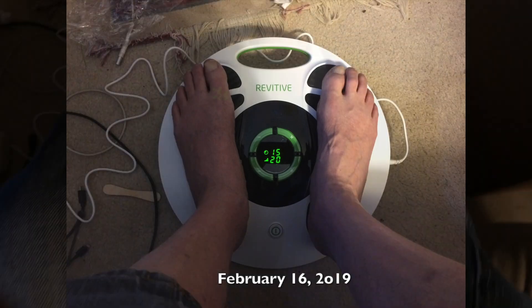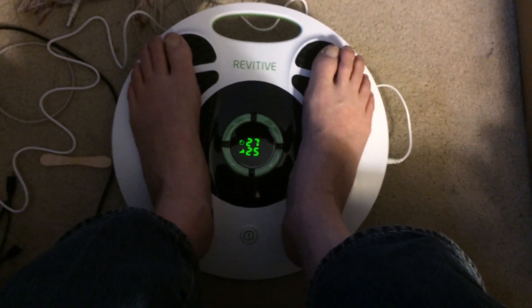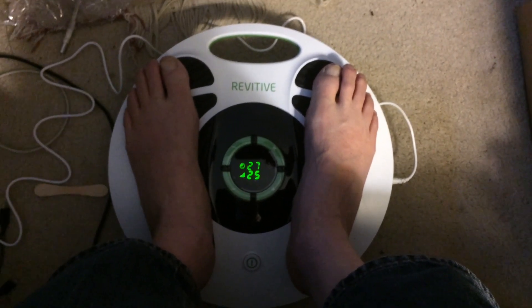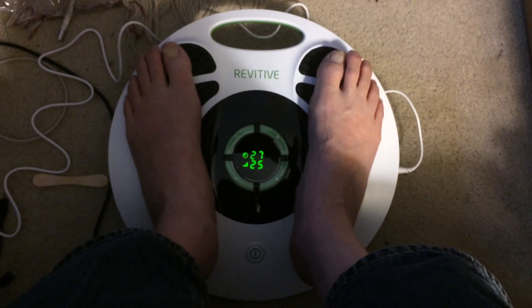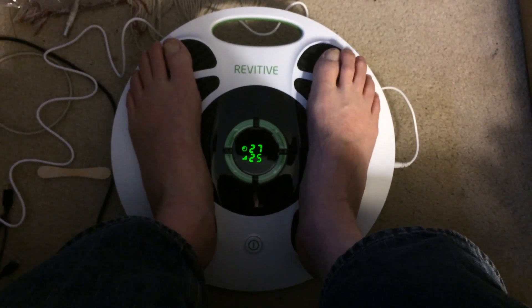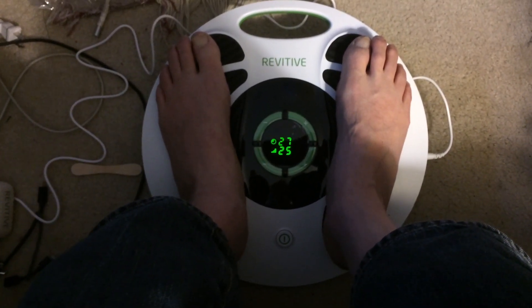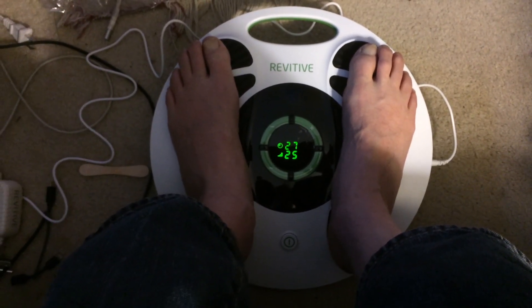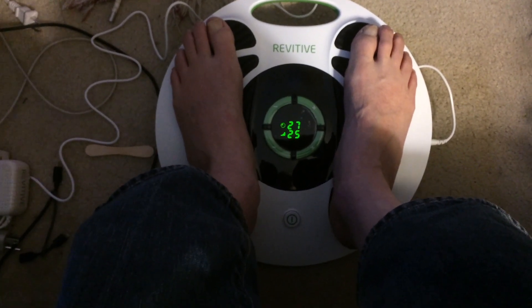This finally came today. It's called a Revitiv. It's a nerve stimulator. Hopefully it'll help me with my balance. If nothing else it might help my feet not feel so cold. It gives you tiny little stimulations through the bottom of your feet that go up your legs.